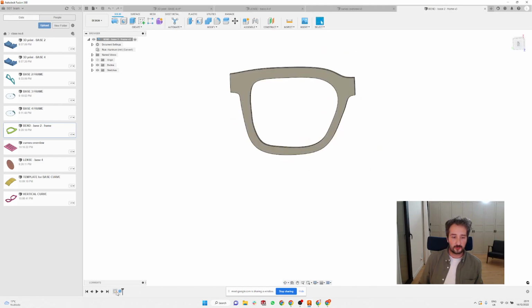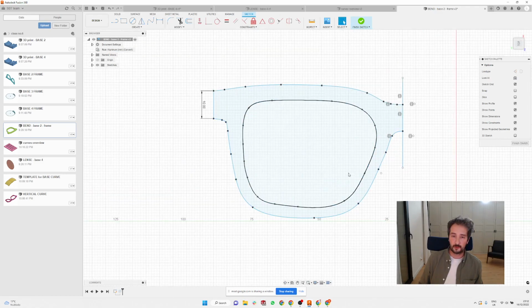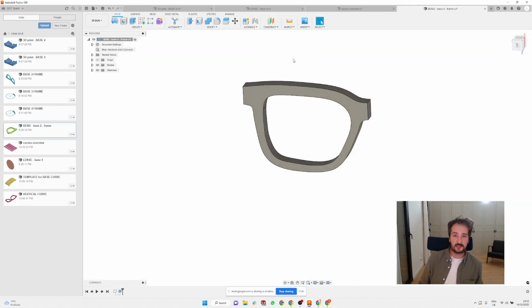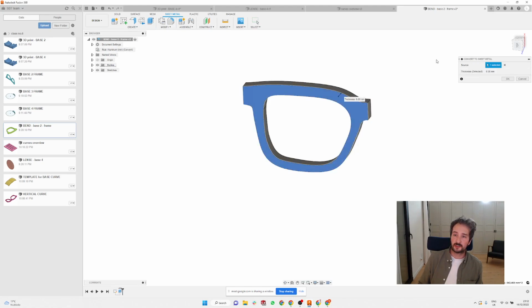So I have here, like I showed you before, how to make a quick sketch of the left side of your frame. So we're going to do something similar. I have one sketch of the frame here, and I'm going to finish it. And then a quite good method to see what the base curve looks like is sheet metal. Here on the top you can see sheet metal, and in Create you roll it down and you convert your shape into a metal sheet. You just click on that surface and it's going to automatically give you the thickness of the frame. And now we can start bending this thing.